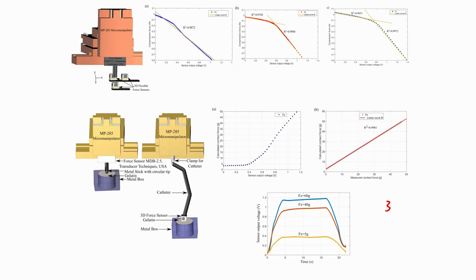The optimum force is somewhere around 35 grams to 40 grams on the heart. Alright. So as you have seen, when the catheter is ablating a heart tissue, that ablation force should not be more than 35 to 40 grams. This is the optimized force. Okay.